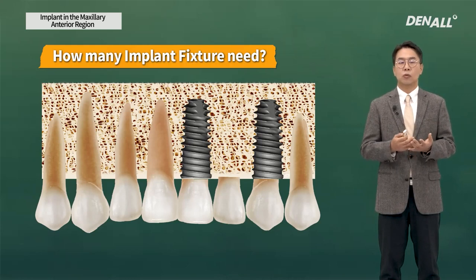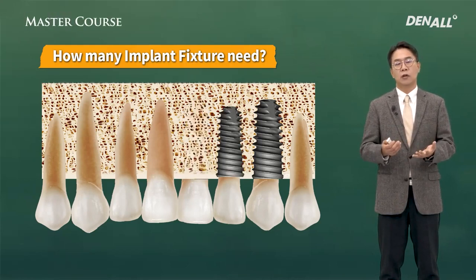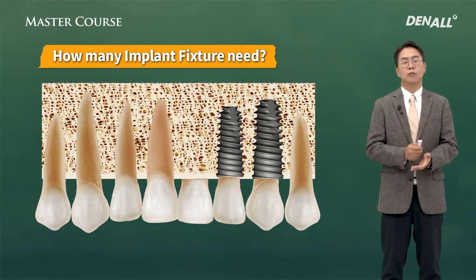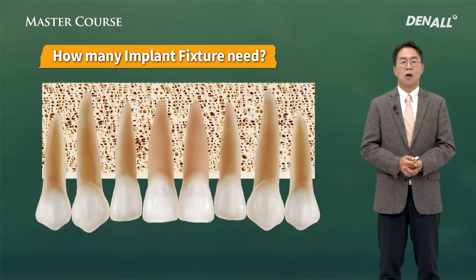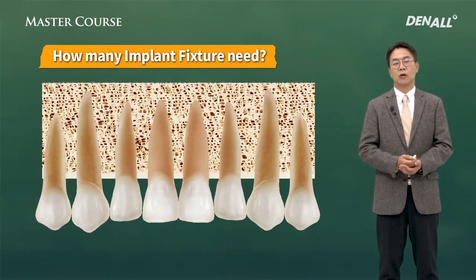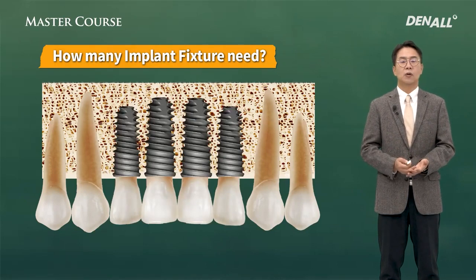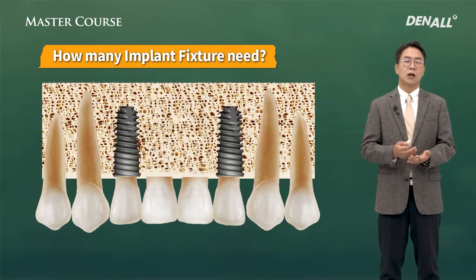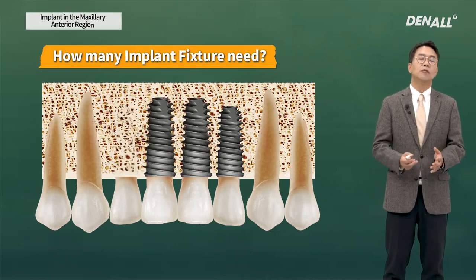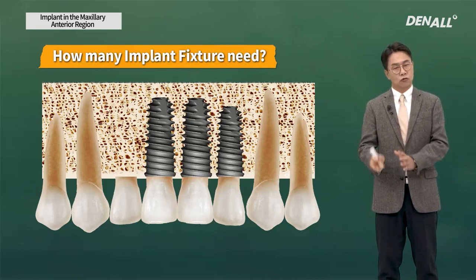If upper anterior has a huge bone defect, we can place 2 implants next to each other and not favorable area can have a pontic. That should be incorporated in the treatment plan. Fitting the situation, if the missing area is broad, we need to determine whether we will restore each one of them or use a bridge, or cantilever, which should be in the treatment plan before surgery.